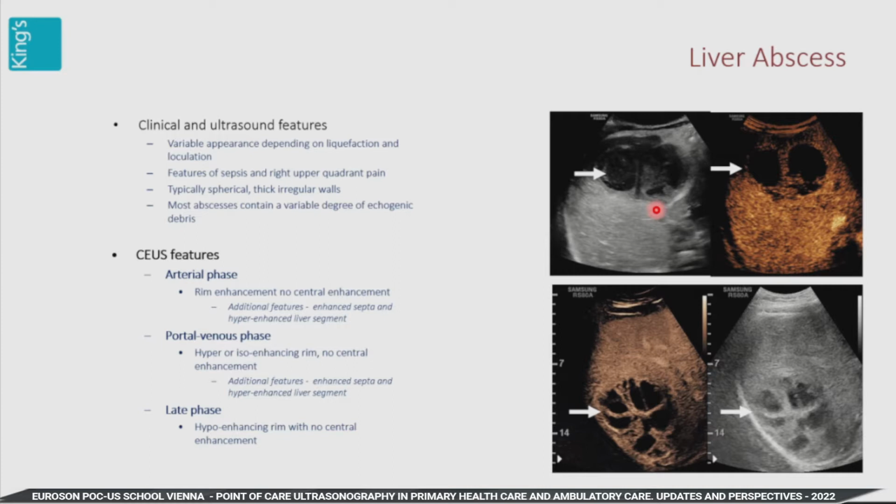If you've got multiple abscesses, you can also drain one of those abscesses, and down the drain itself put a small amount of contrast. 1 drop in 20 mils is all you need of the contrast. Inject it and see whether those abscess cavities are draining with each other. And you know you don't need to put more than 1 drain in. But it gives you the diagnosis almost immediately.